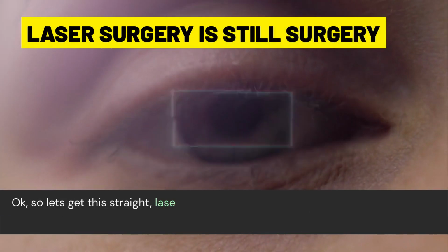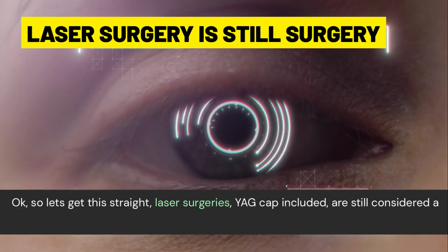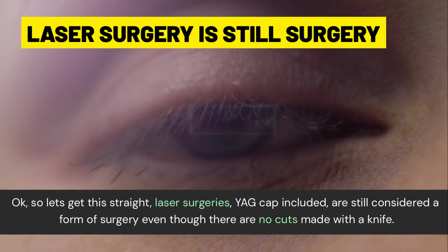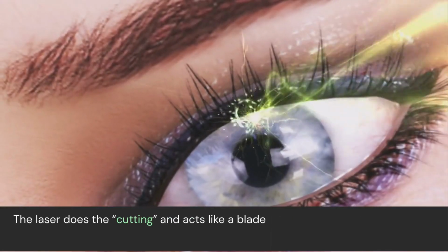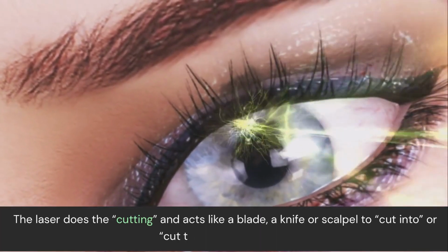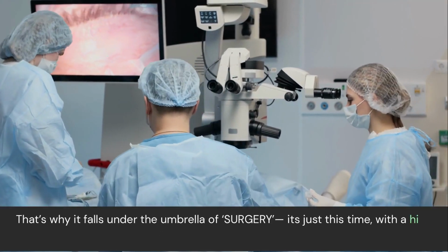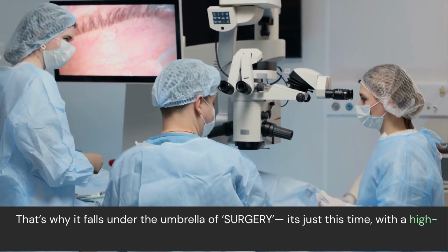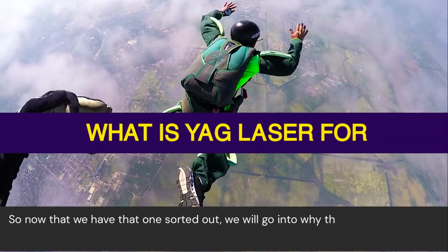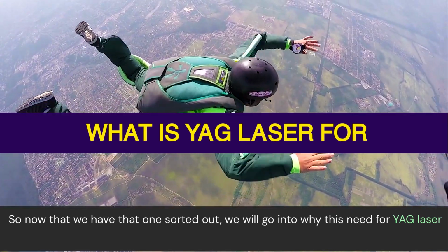So let's get this straight. Laser surgeries, YAG cap included, are still considered a form of surgery even though there are no cuts made with a knife. Imagine this, the laser does the cutting and acts like a blade or a knife to cut into that body tissue. What I'm basically trying to say is laser is still surgery, just a more high-tech kind. So ayan, now that we have that one sorted out, we'll now go into why this need for YAG laser surgery. Ba't kailangan ng surgery?